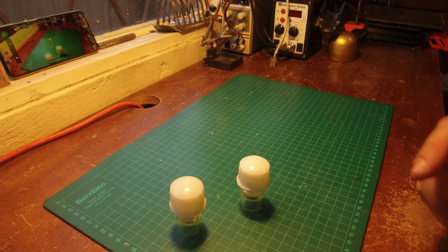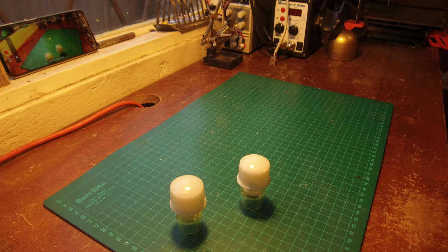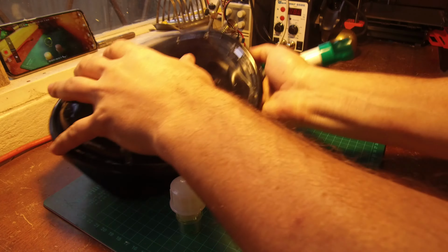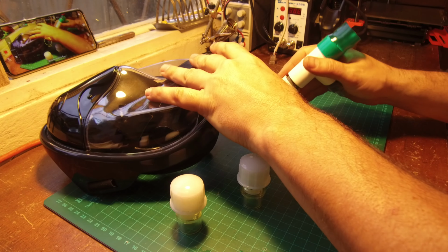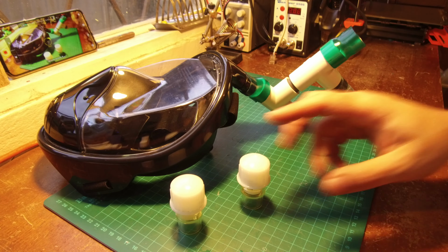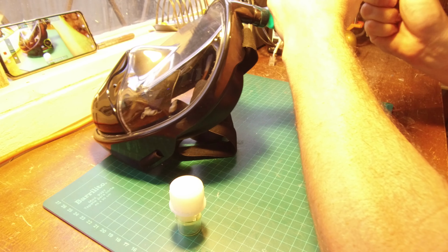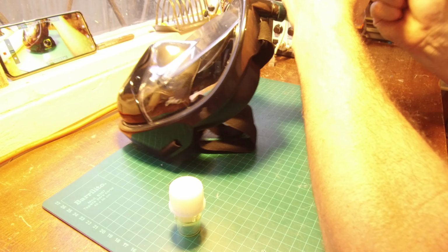So basically what you need to do is put all these things together with a circuit like this one. This one is made of 1/2-inch PVC valves and a rubber hose heated with hot water. You have to put the valves here.